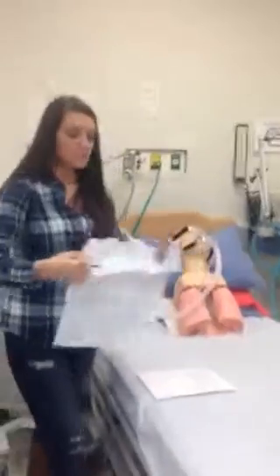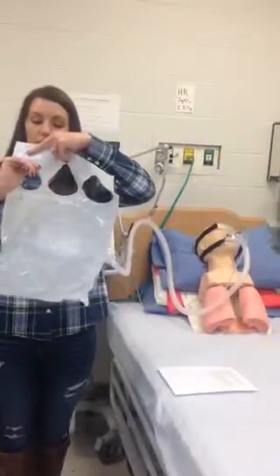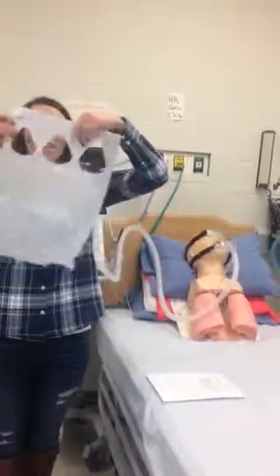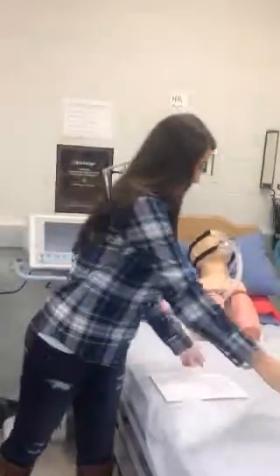I would fit her using this plastic guide, and since she is a smaller lady, I would start with this smaller opening, and you want this to be on the bridge of the nose and this to be below the chin. After fitting her with that, she would need a medium. I want the top of the mask on the bridge of the nose, and the bottom to be right on the chin.